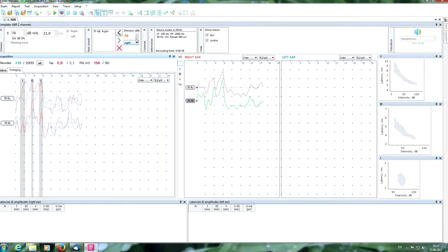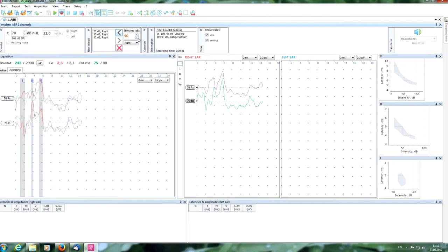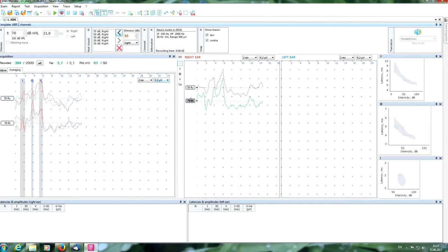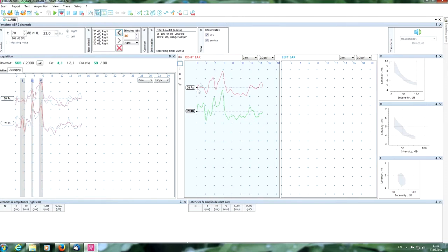And start the second cycle of stimulation to check the reproducibility of responses. Also we can form the automatically line of stimulation. For example, if we look for threshold. We can add different intensities. And the wave will be made automatically. If you want you can switch off the contralateral curve.